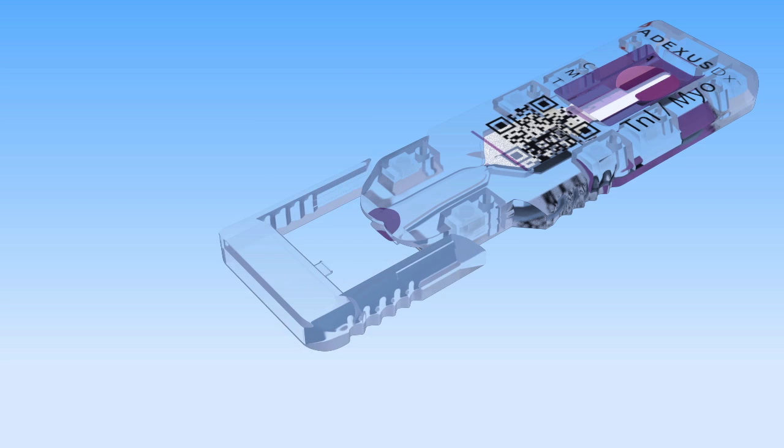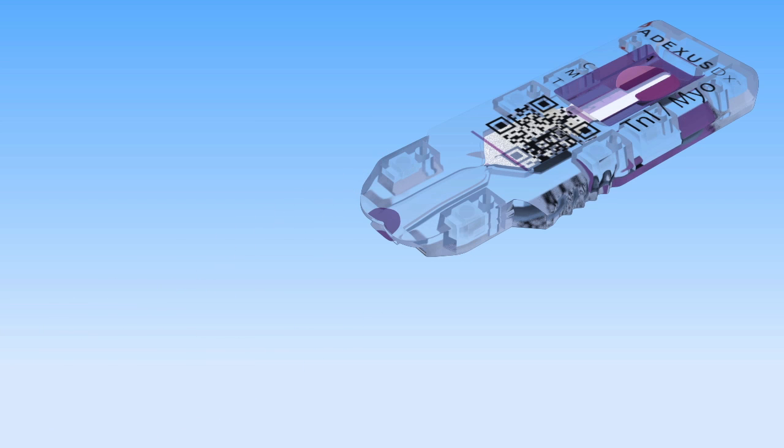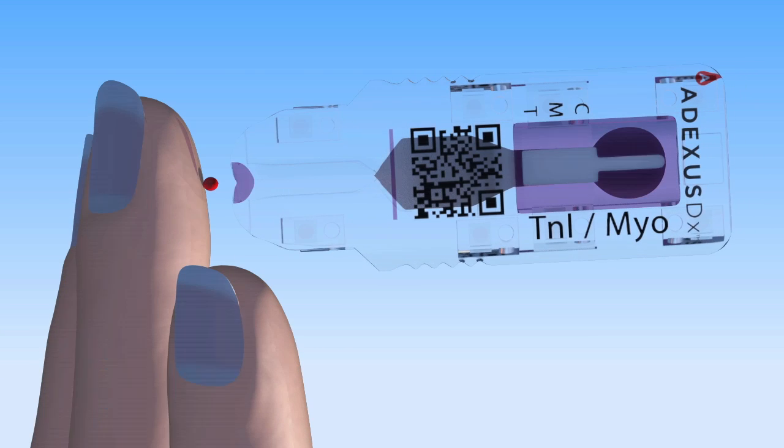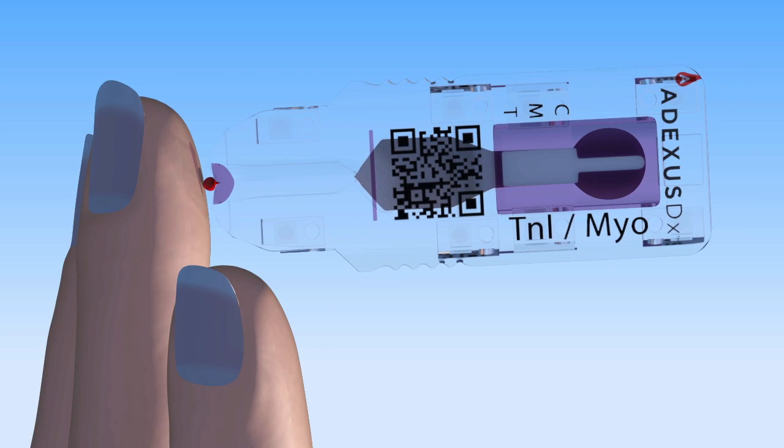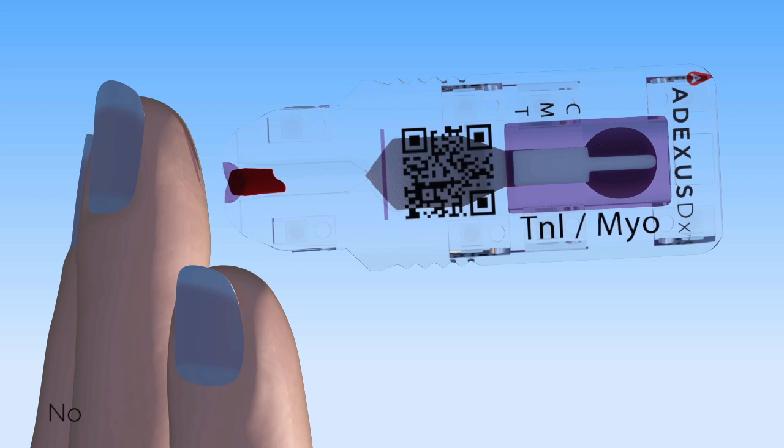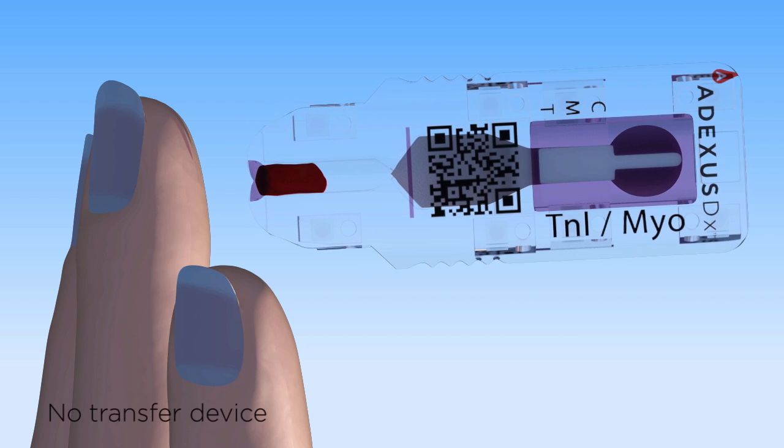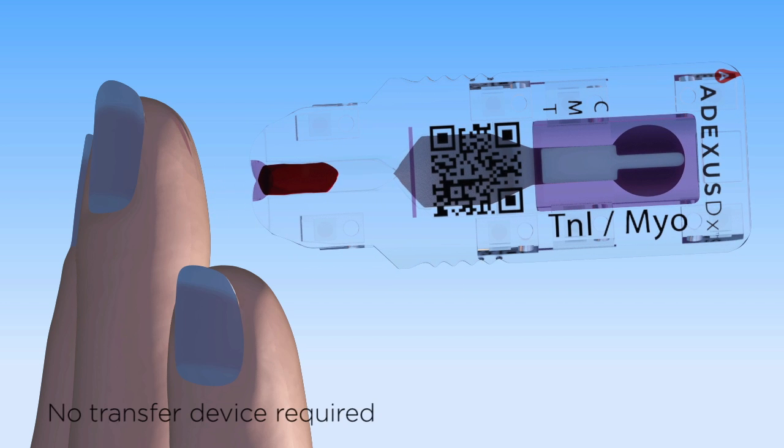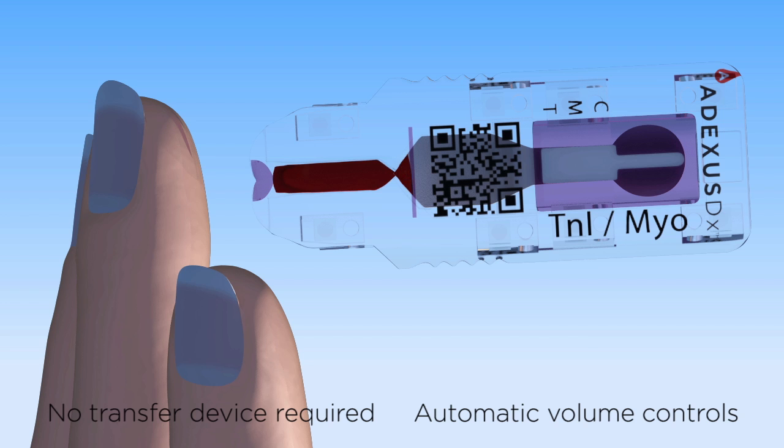First, the cap is removed from the device. A single drop of blood is drawn into the test. There is no transfer device or processing required, and automatic volume controls are in place.